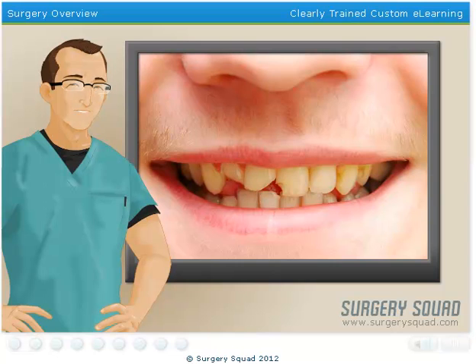A dental crown is a tooth-shaped cap that is used not only to restore the strength and functionality of a tooth, but can also improve its overall appearance.